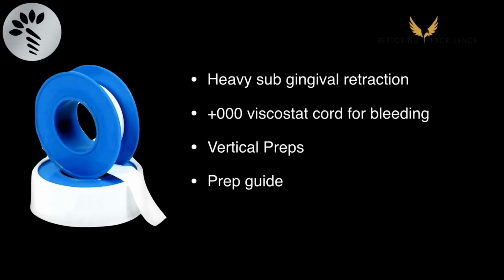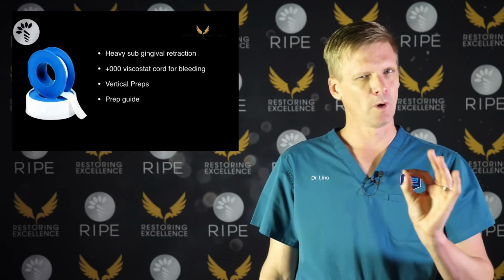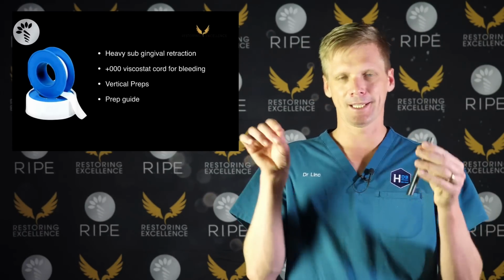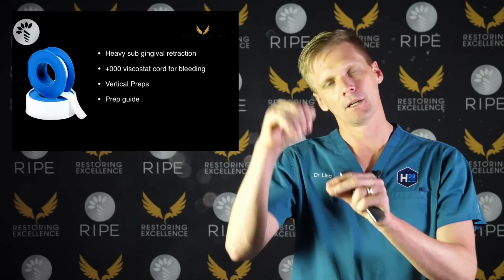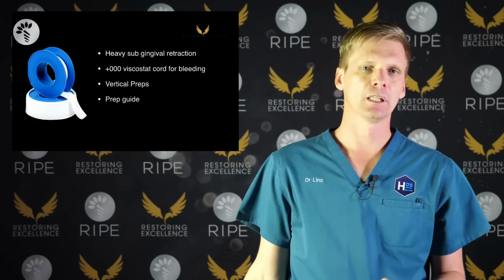Now, when do I use it? I use it when I want massive retraction. So now when you use this for the first time, you have to be a sadist, okay? You don't just put this in and go, oh, push it in gently. You've got to push that in super hard and press it down super hard, and it will cause up to 2 millimeters of retraction.